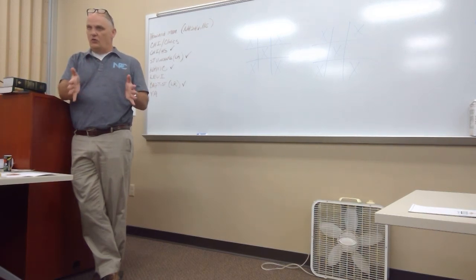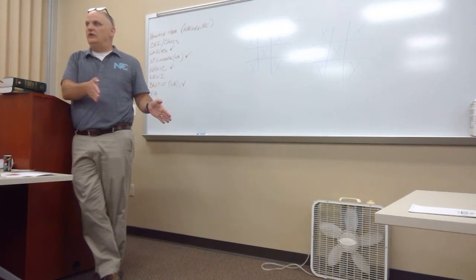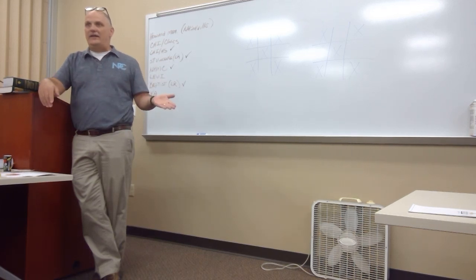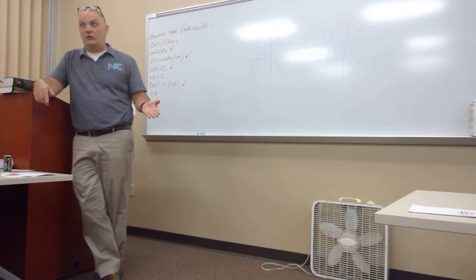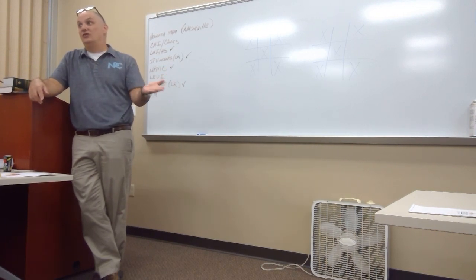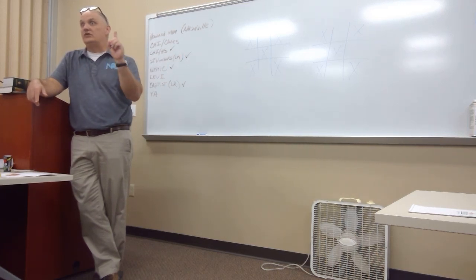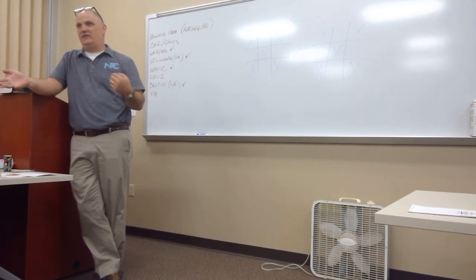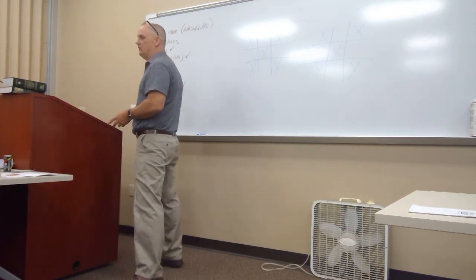Now remember, what's the normal range for white cells in spinal fluid? 0 to 5 per microliter. That's nothing, okay? Basically you shouldn't have it, but they do give you a 0 to 5. But if you're doing a white count on somebody on spinal fluid and they have 500 per microliter, now if they have a majority of SEGs, that could be bacterial meningitis, okay? But if you're doing that cytocentrifuge and you see 1 SEG, that doesn't necessarily mean anything, okay? First of all, the big thing is you have to have an increased white blood cell count to start out with.